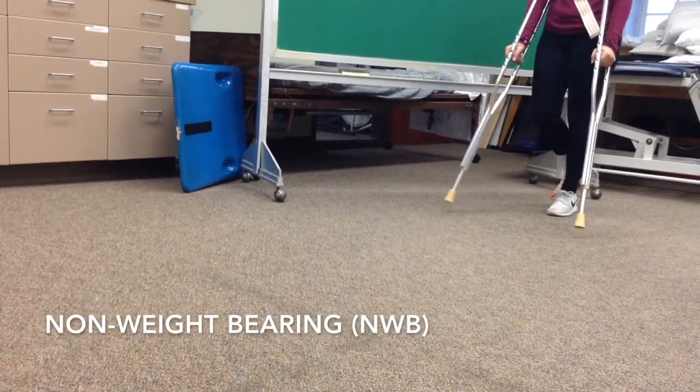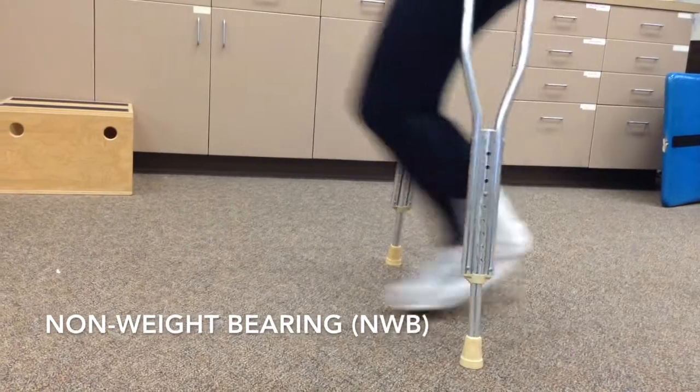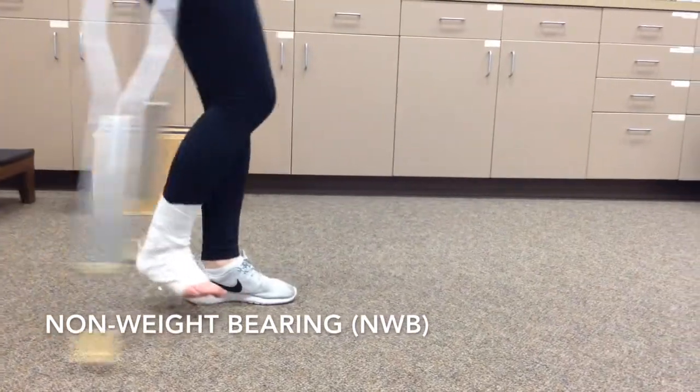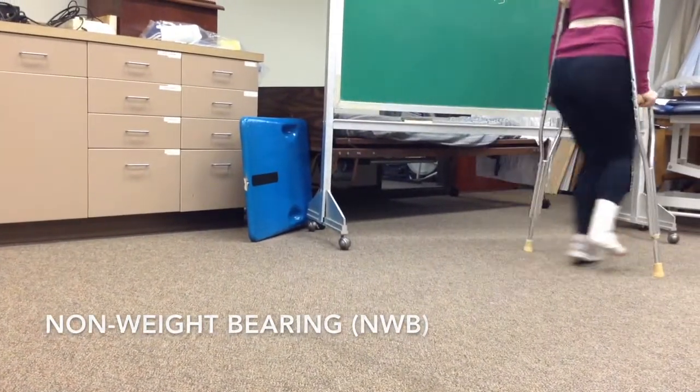A status of non-weight bearing means that the involved lower extremity is not bearing weight. It is not allowed to touch the ground at all. You can tell the patient to bend at the knee or hip to keep the foot off the ground.